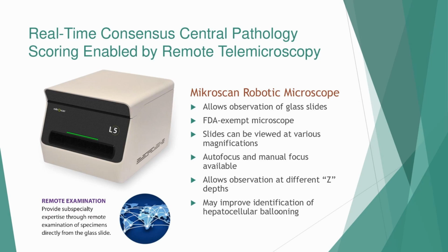So this allows direct observation of the glass slides through streaming software. It's an FDA exempt microscope for the live view, like Jason had mentioned. The slides can be viewed at various magnifications. There's an autofocus and a manual focus available. Sometimes that's helpful when we're looking at very detailed features like balloon cells, for example, in fatty liver. Obviously, if you're looking for smaller features like viral inclusions, it's helpful to be able to autofocus and make sure you're seeing what you believe you are seeing.